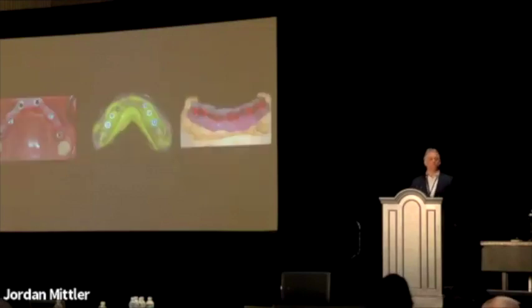So what problem does photogrammetry solve? Well, for years, if any of you have taken a full arch impression, it's the worst experience in the world. It's technique sensitive. The clinician has to know what they're doing. There's all kinds of room for error in the process. So if I want to duplicate the patient's implant position, typically we were doing verification jigs. We had stone issues, technique sensitivity clinically.